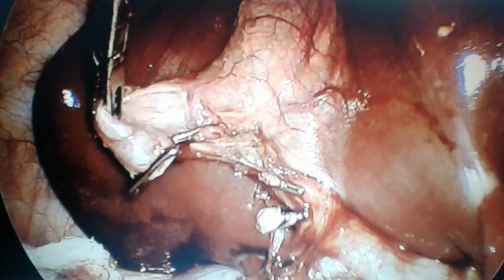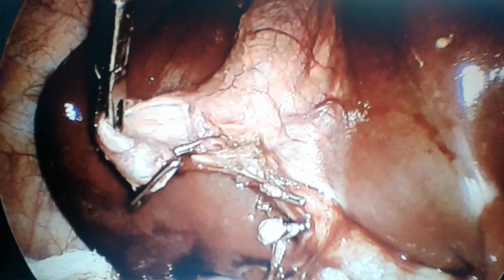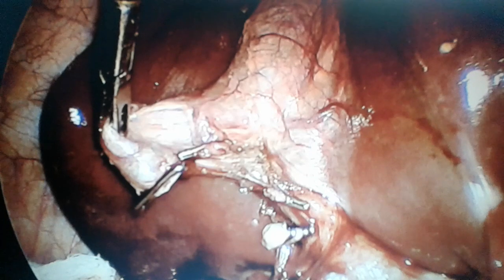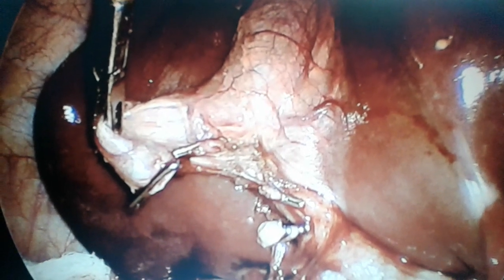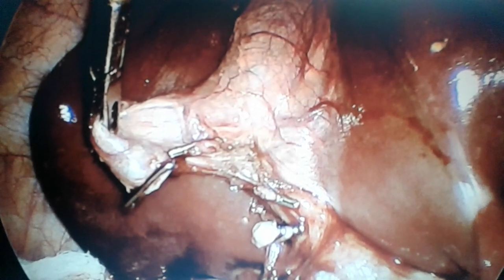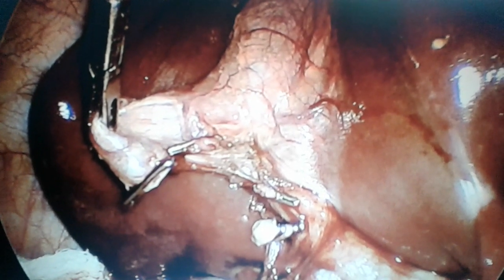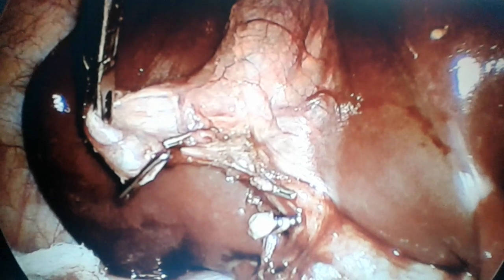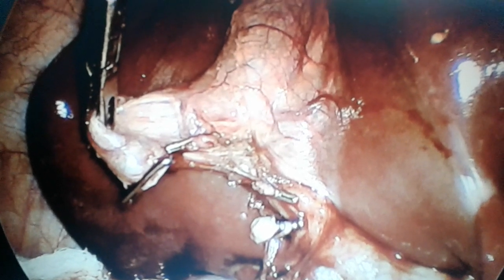Now, just for the learning purpose, especially for the postgraduates, there are so many unwanted situations that may arise, although not dangerous, but yes, it can increase the pulse rate of the operating surgeon, and few such situations we are going to discuss during intraoperative period in a patient of gallbladder stone disease undergoing laparoscopic cholecystectomy.